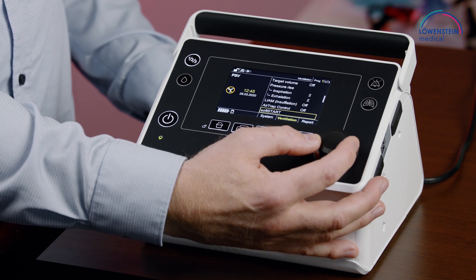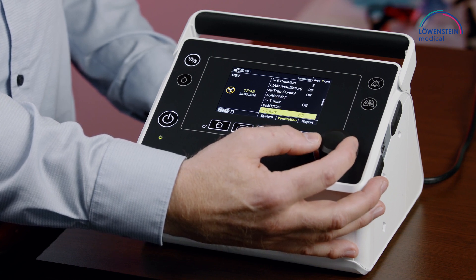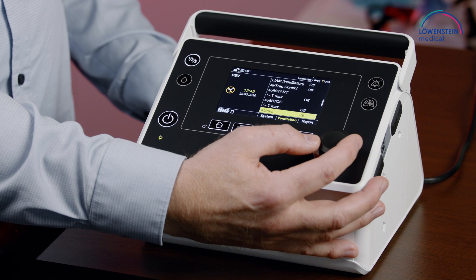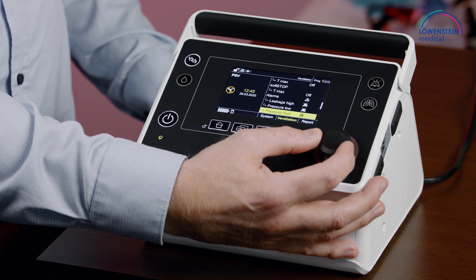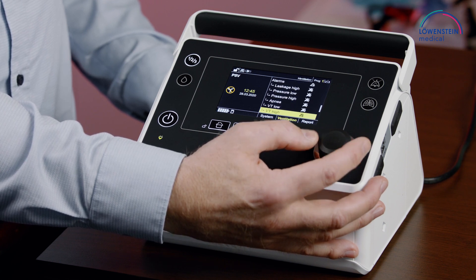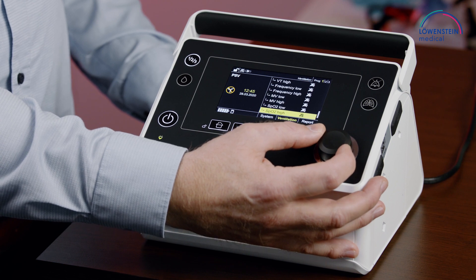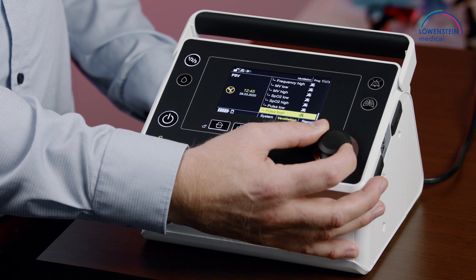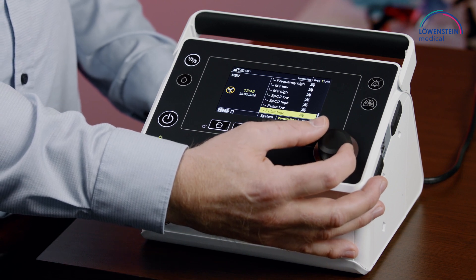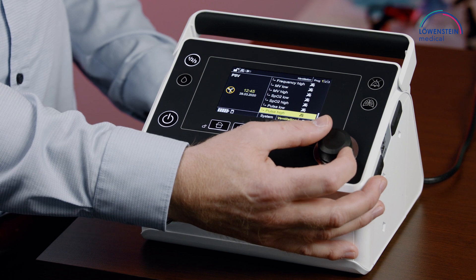We have certain parameters that can be set, and at the end of the list we have our alarm settings, so you can select every single value that is important for the ventilation.